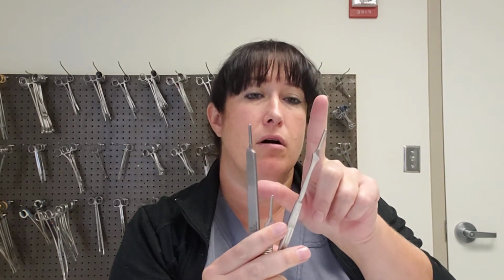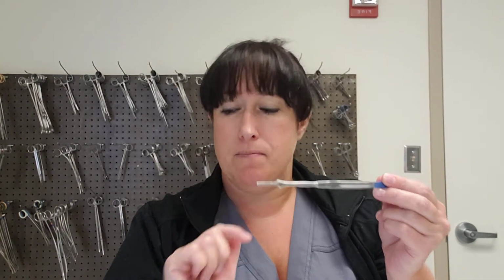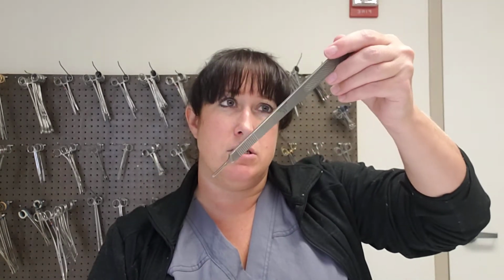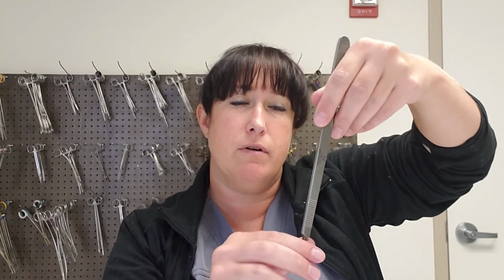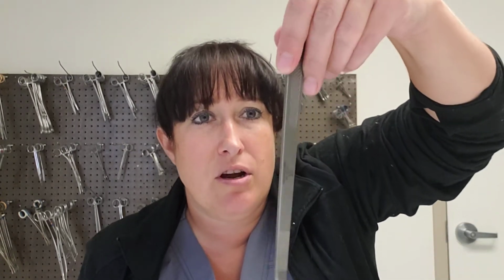But if I did, it would fit on one of these 3 handles, the 3 long, or the 7. And in fact, if we're using it for tonsils, I would use it on the 7 because the 7 is longer than the 3. You don't really need it to be this long, do you? That'd be a pain. The longer an instrument is, the more a surgeon doesn't have control over it. If they're having to reach pretty deep, they're probably not going to be able to grab it very well like you would the 3. But if they're trying to go deep, the longer it is, the less control they have over the end. So you really don't want to give them the longer instruments unless they really need them.